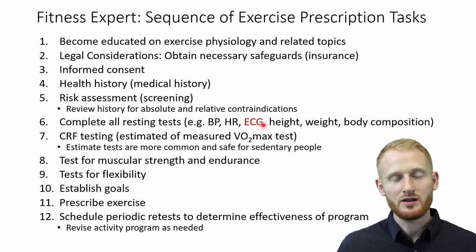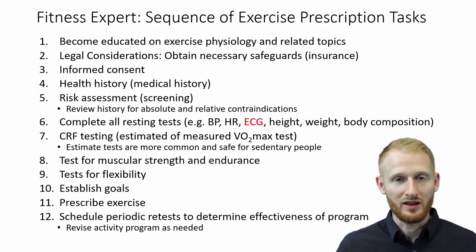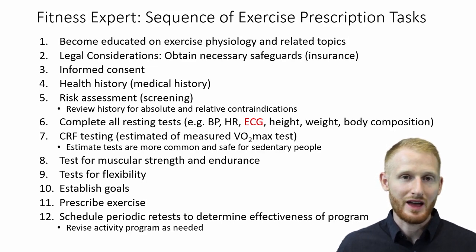An electrocardiogram is pretty common in a clinical setting, but if you're in a fitness center or gym type setting, you probably won't be doing ECGs or interpreting them yourself. But you might be getting clients who've had ECGs done because of various issues in their past, and you want to know a little bit about ECG so you can understand what was found and how to then treat that client.